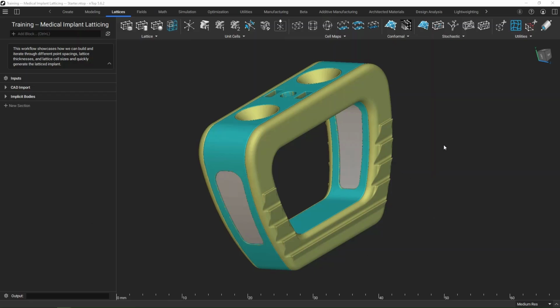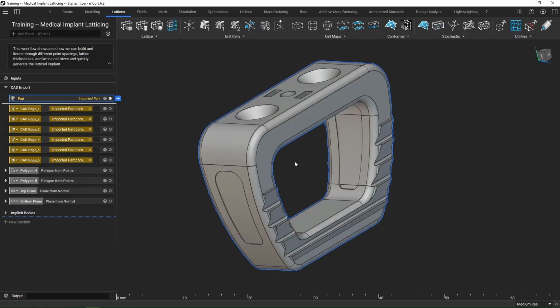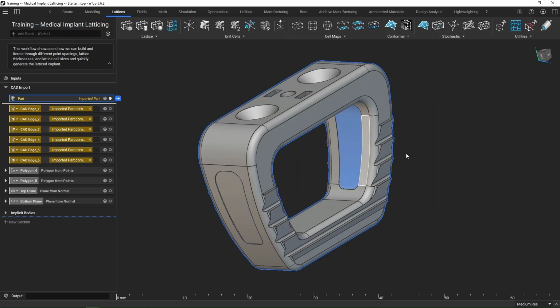So here we have our file. We've got that starter file that you can start out with as well, so you don't have to worry about building those different implicit bodies, as you can see that are colored here. If you're curious, you can see we've got an imported CAD geometry. By double clicking through here, I can see we have 3 different bodies that we're working with.